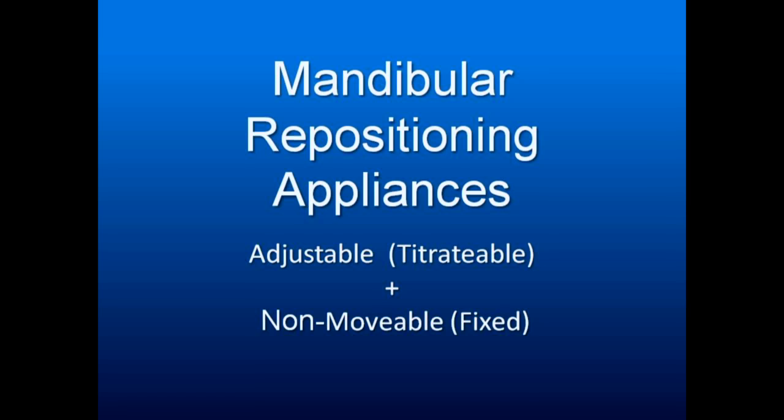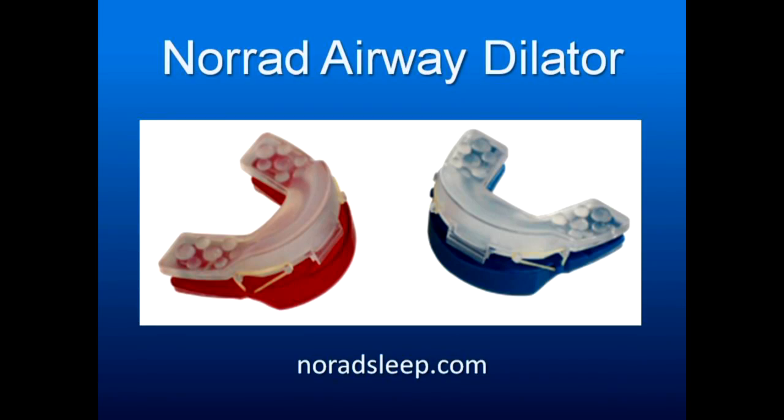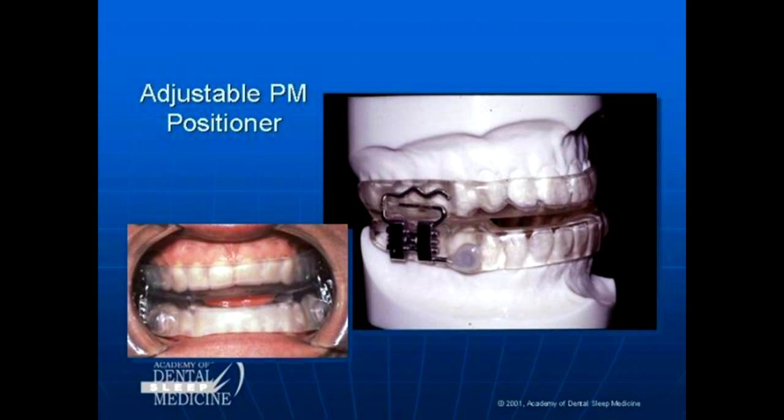Mandibular repositioning appliances that are adjustable, titratable, but the patient can't move in them. Still not, they're a step in the right direction, they were a step forward, not usable now. Very easy to use, Norad Airway Dilator, boil and bite, can help hold the jaw forward. The adjustable PM positioner, this was designed by Jonathan Parker.